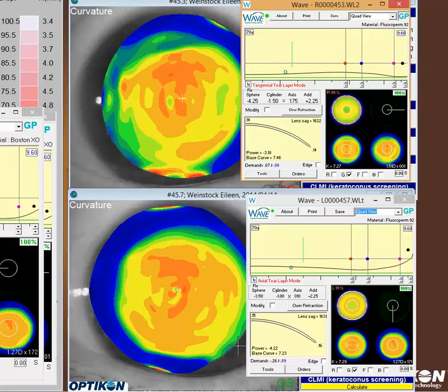So with that setup, when I'm struggling getting a lens to center well, I generally go back and look at the topography, reopen the lens, and this time when I import the data, I do not average out the astigmatism. That usually gives me a little bit more true representation of the cornea.